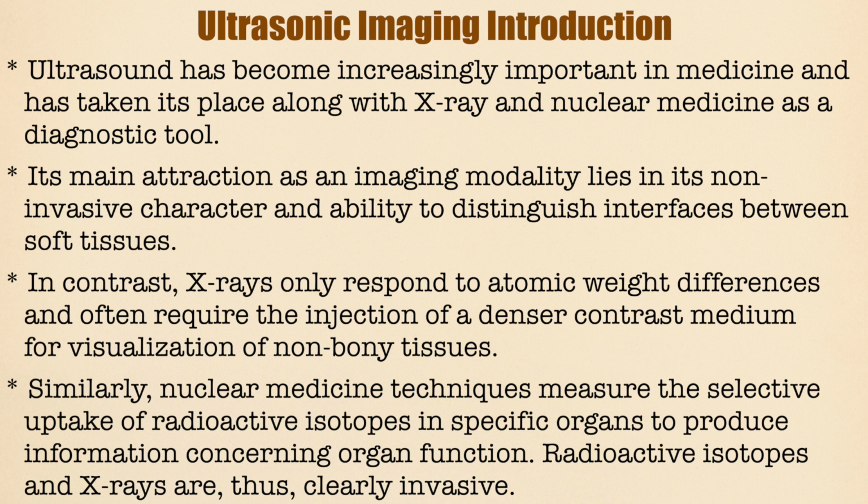Its main attraction as an imaging modality lies in its non-invasive character and ability to distinguish interfaces between soft tissues. In contrast, X-rays only respond to atomic weight differences and often require the injection of a denser contrast medium for visualization of non-bony tissues.